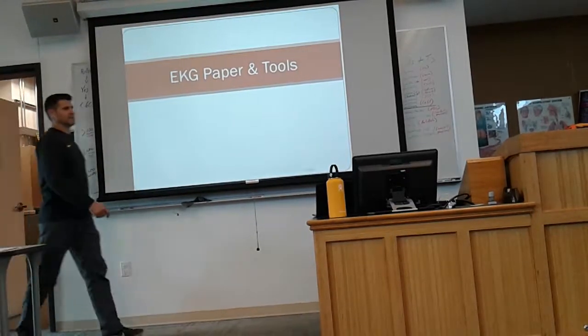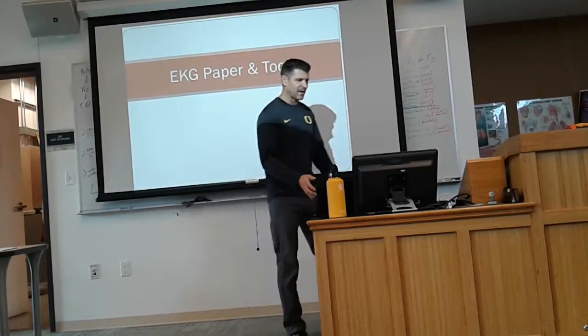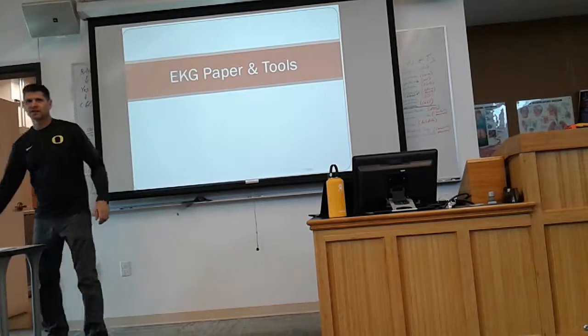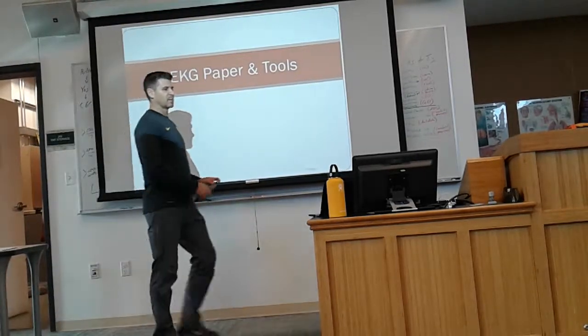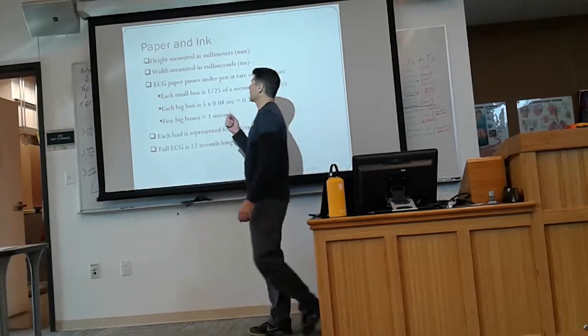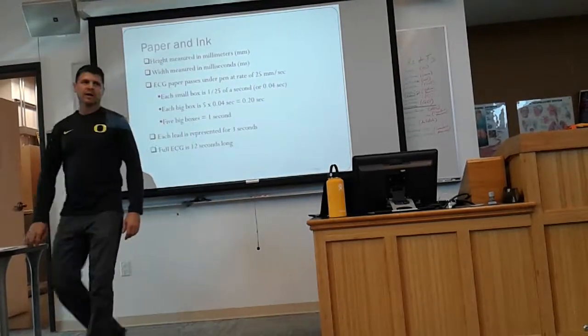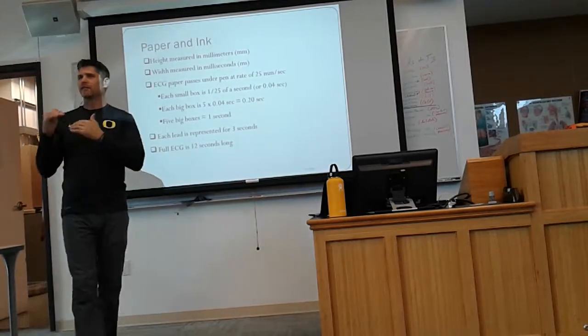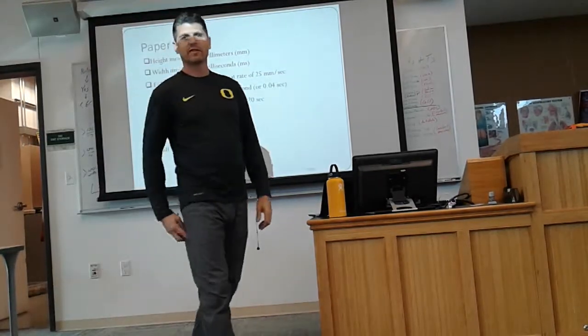Just some logistics about EKG that you have to know in order to start your analysis. Some common things you need to know about EKG and some misconceptions. One, let's talk about the paper and the ink real quick. The height, I've already talked about, but the height is measured in millimeters.